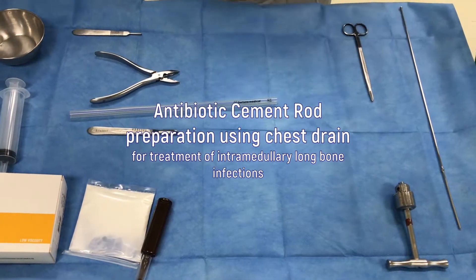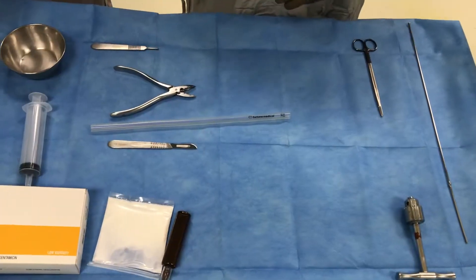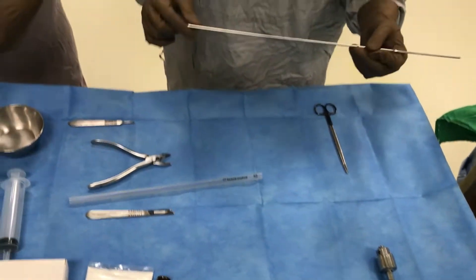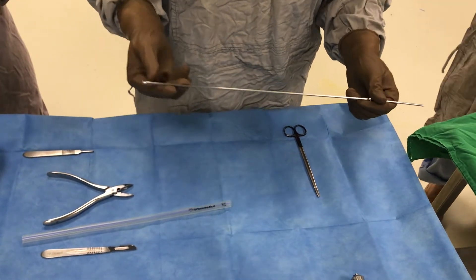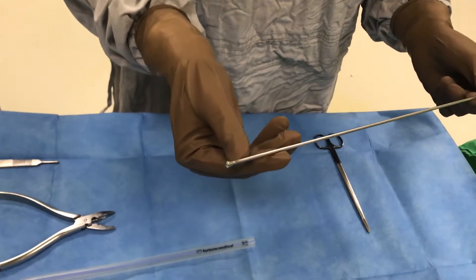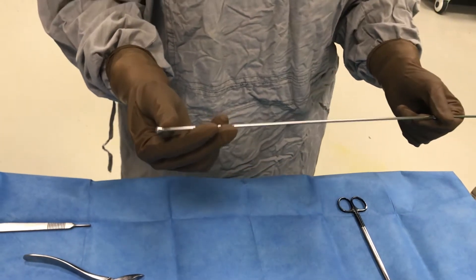This is the demonstration for antibiotic cement rod preparation. To prepare this we need some instruments, like a strong wire for the core of the cement rod so it can be placed and extracted easily without any breakage of the cement. It is good to have a beaded wire which is beaded at the end so it can go at the end of the cement rod and will provide stronger support.